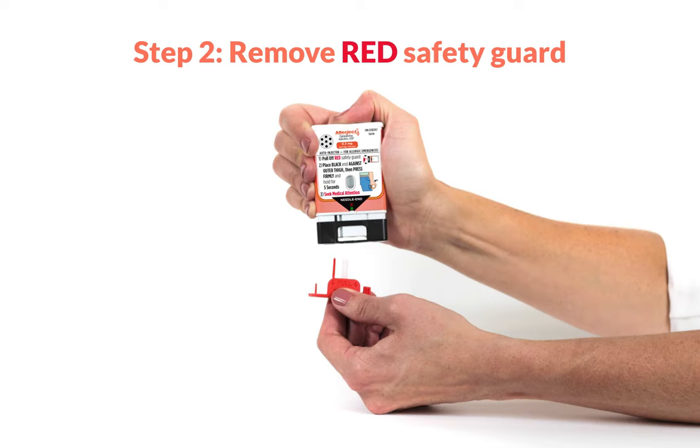Step 2. Pull off the red safety guard. Pull firmly as the safety guard is meant to be tight. Once the guard is removed, be sure not to touch the black base of the auto-injector, as this is where the needle comes out.